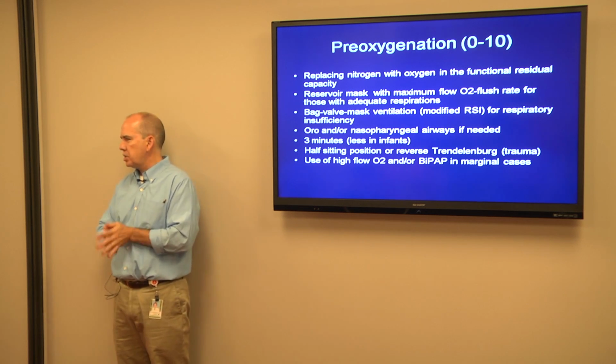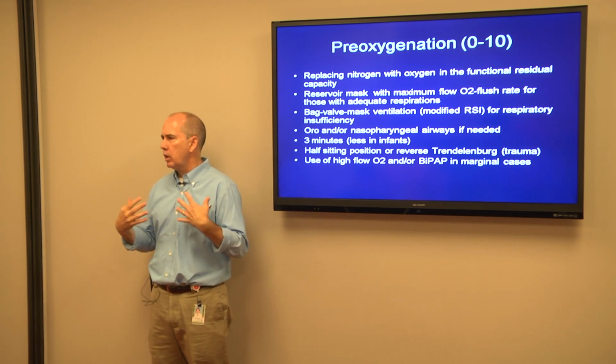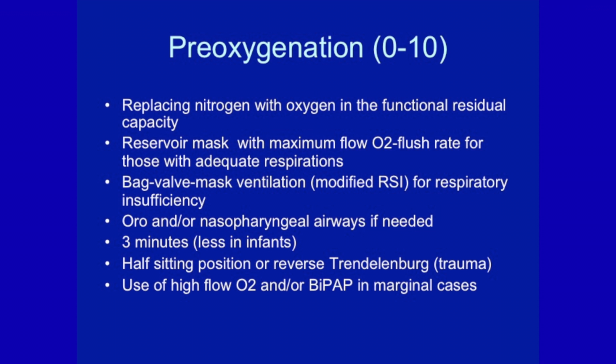Pre-oxygenation, we're headed toward a change in how we recommend this, primarily for the RTs. So what are you doing? You are filling your functional residual capacity with oxygen instead of nitrogen. Non-rebreather masks are not 100% FiO2 masks. At best, the way they're typically used, they deliver 50 to 60% because you entrain so much room air. There's now a fair amount of literature suggesting that if you use a flush rate instead of 15 liters, so when the respiratory therapist hooks up the non-rebreather mask, they turn it all the way up, it increases the FiO2 significantly.